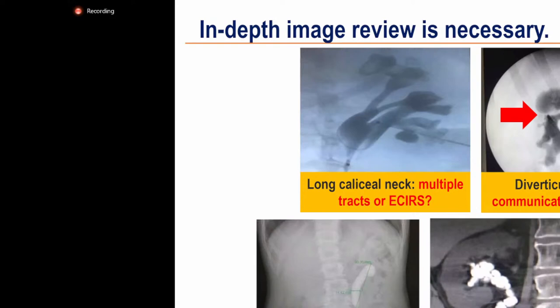You can see the obstructed ureters with many stones in the lower three figures. No fluoroscopic retrograde identification of the renal calyces is available, and the use of ultrasonography is mandatory in this case. So all these cases have to be considered for preparing a combined approach, but not a simultaneous approach, because we can put some priority on the retrograde or antegrade approach.